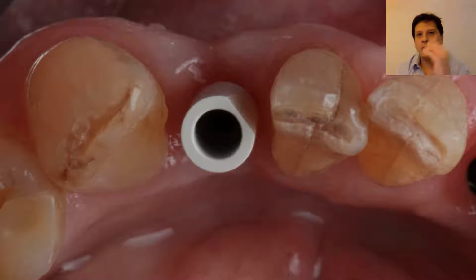But the downside of doing that is that blocks only have monochromatic colors. That means A2 is A2. Even if you try to characterize with some glazing, it's not the same as when you need characterization from the feldspathic veneering material. So the second option is to have a model with the analogs, where your ceramist can feldspathic veneer your zirconia framework, and that's what we did in this case.